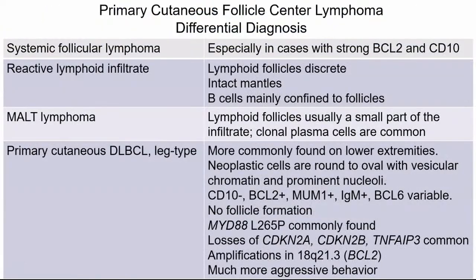As far as the differential diagnosis, we should always consider the possibility of a systemic follicular lymphoma, especially in those cases that have strong BCL2 and strong CD10. Reactive lymphoid infiltrates also enter the differential.